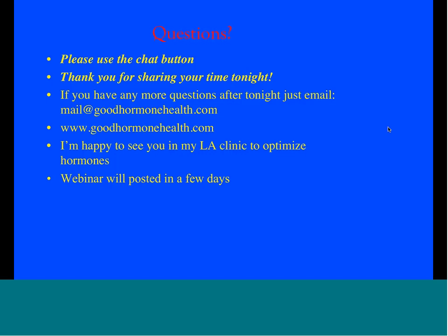Somebody on prednisone, which probably doesn't cross-react with the assay, is probably not going to find it that helpful, I would say. Again, somebody on prednisone might be making some cortisol themselves, and it might be helpful to see how much you're making yourself. The results are immediate, yes, within about 10 minutes. Am I understanding correctly, this device will tell you cortisol right away? Yes, correct.